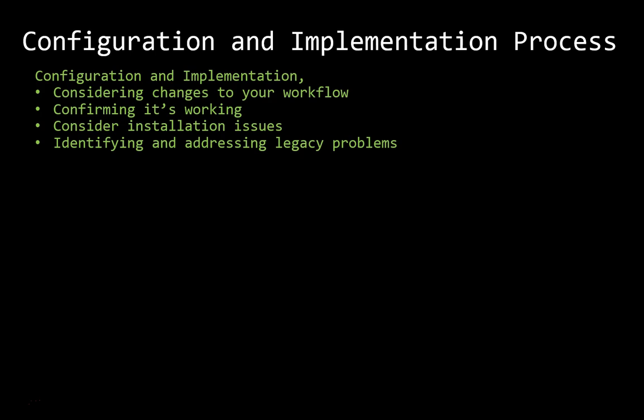These sections are intended for the implementation team. They discuss important clinical and IT considerations when deploying a RIS system with IHE capabilities, including dealing with legacy issues when connecting the RIS to systems that do not support IHE profiles. So, consider your workflow. IHE profiles are designed to implement digital imaging in a streamlined clinical workflow. To gain the full benefit of these changes, there are several tasks that need to be performed in the correct manner, and they are done by two profiles. Guess what? They're SWF and PIR.